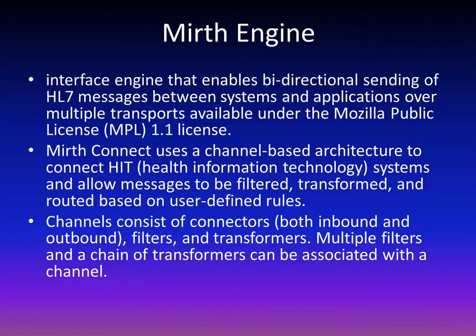Mirth uses a channel architecture to connect health information technology systems and allows messages to be filtered, transformed, and routed based on defined rules. The channels consist of connectors, and there are multiple different kinds of connections you can perform. In our case, if we want to do an interface with an EMR, an electronic medical record, a lot of nursing homes, but certainly every hospital, is going to have its own EMR system.